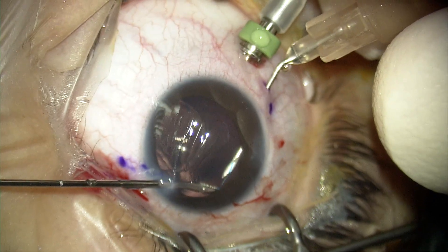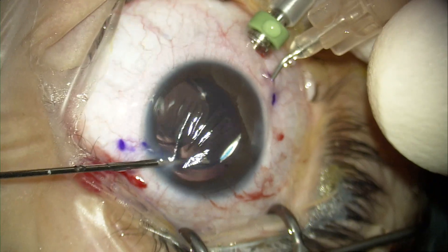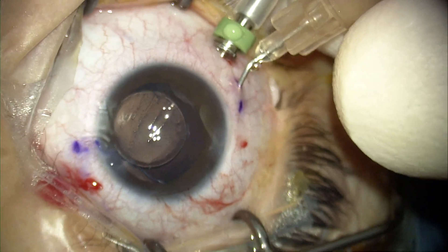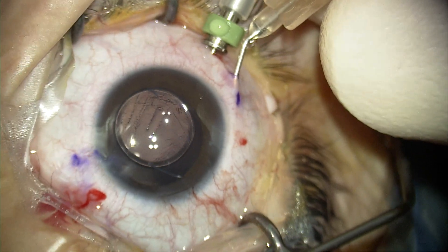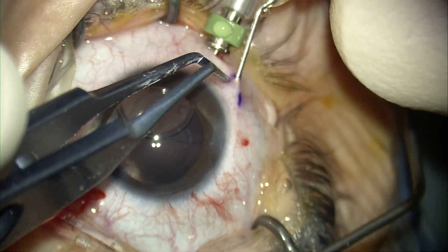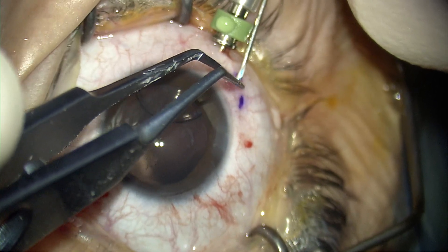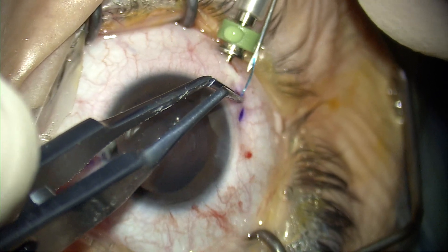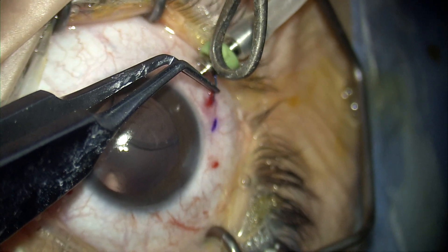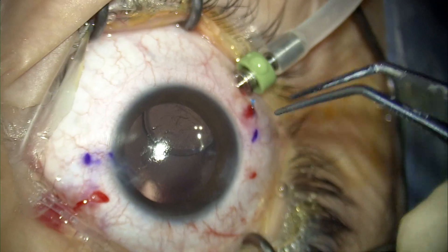The second haptic is usually more difficult just because of accessibility. A trick is to push the IOL with your needle away in order to properly visualize the haptic, grab it, and dock it into your needle. Once again, very slowly and gently remove the needle from the scleral track, and be ready with your tying or grasping forceps to immediately grab the haptic as it becomes exteriorized. Cauterize it — and importantly, when you cauterize the haptic, don't touch it directly, as you can burn or break it. Apply heat very close to the haptic to create the flange.